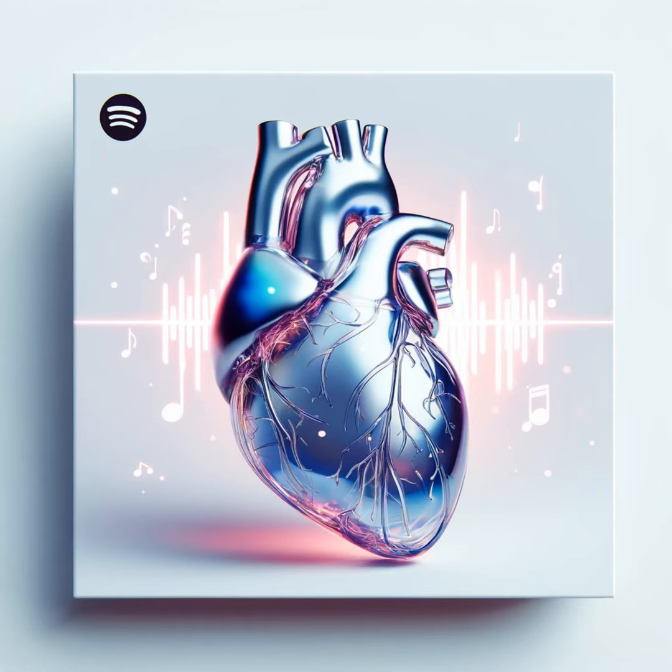A few final words on waveforms of the RV, PA, and wedge. On the left side, on the wedge waveform, the pulmonary arterial wedge pressure, a high V wave means mitral regurgitation. On the right side, a high V wave means tricuspid regurgitation.